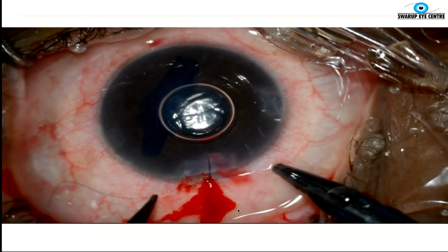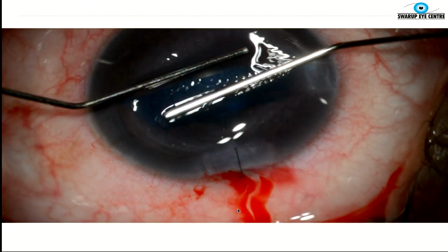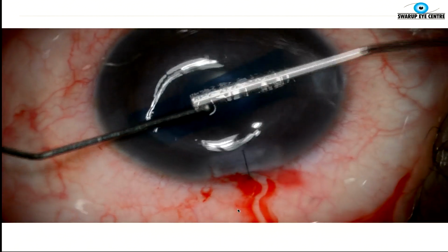I'm sure Ashish will show us some of these complications. It's a good idea to suture these wounds, at least initially. And then, of course, you can start all your tapping maneuvers.